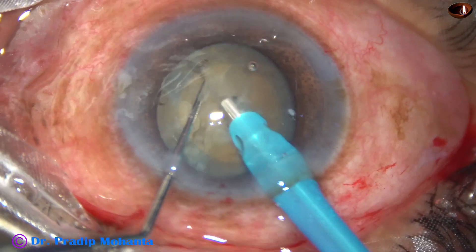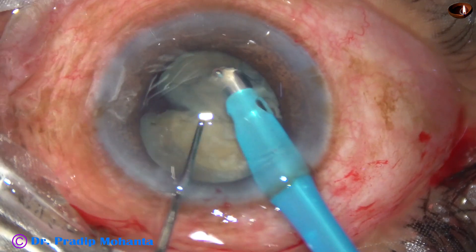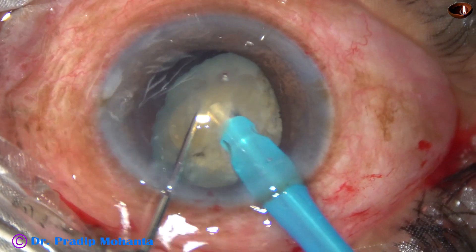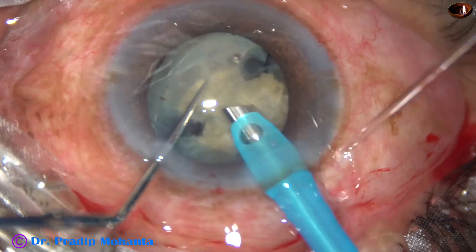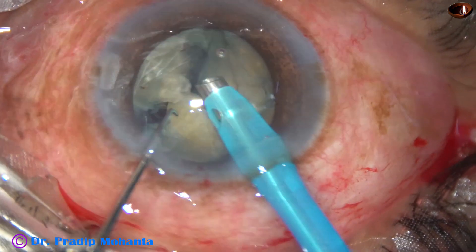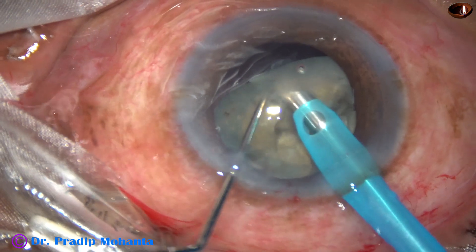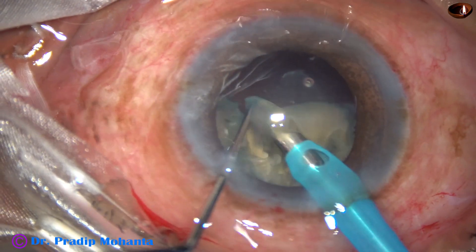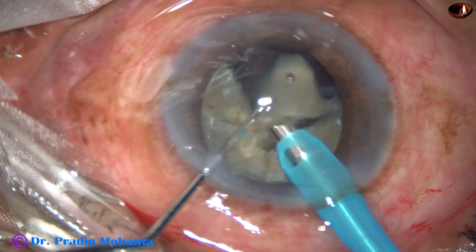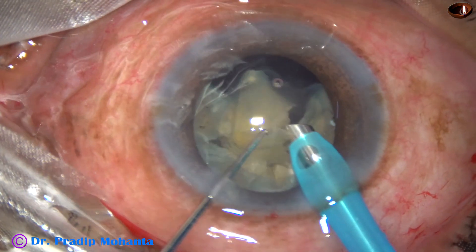When there is zonular weakness, we cannot hurry up. We have to be extremely patient as well as 100% alert. Anytime zonular dialysis can occur and we have to notice it very early. As I emulsify this piece and then this small piece, and as I try to hold this piece, I notice there is zonular dialysis at 6 o'clock. Something is fluttering at 6 o'clock at the equator of the bag. Yes, that is zonular dialysis.